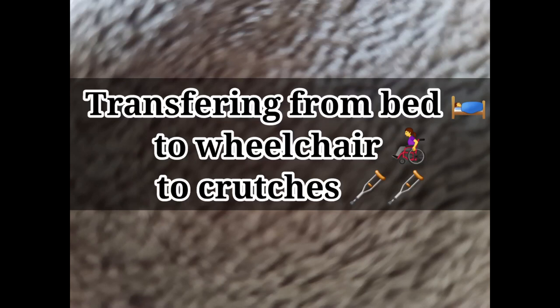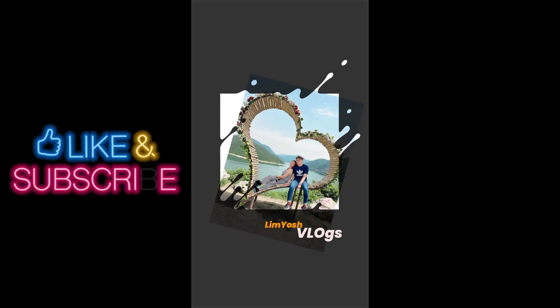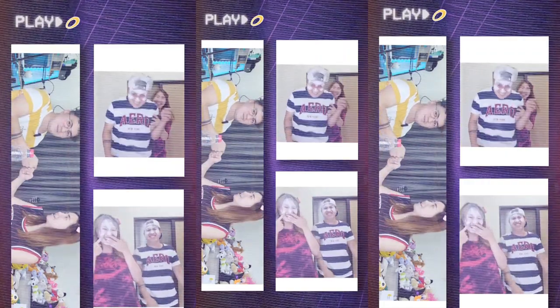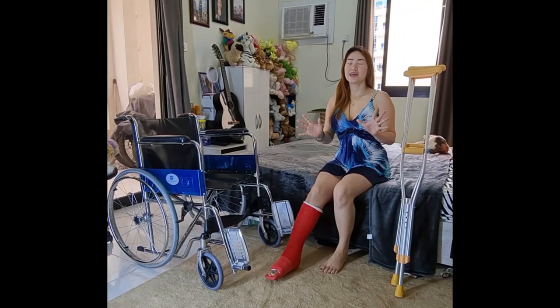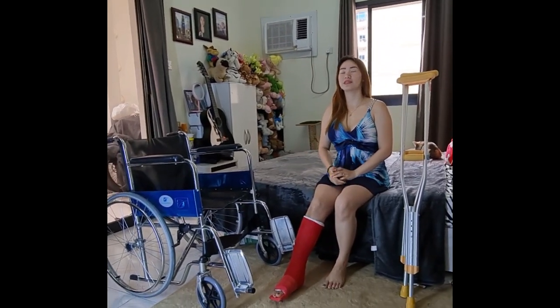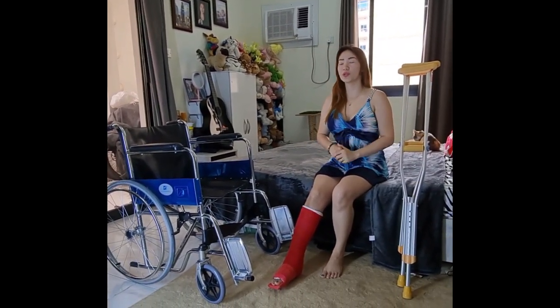Transferring from bed to wheelchair to crutches. Hi guys! For today's video, I'm going to show you how my daily routine goes every time Limuel is going to work.